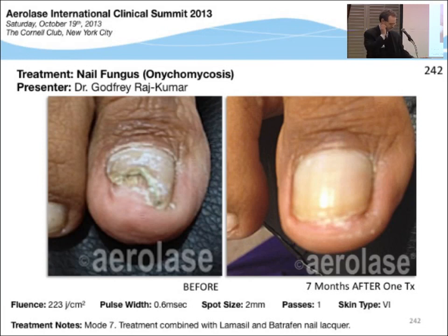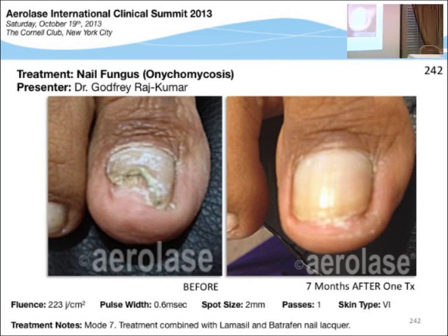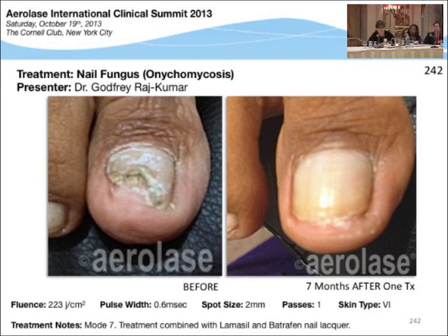Thank you. I use a Zimmer to cool, and I don't have an issue. A Zimmer is a cooling machine. I have it because of so many of my lasers, and I just blow really cold air through the Zimmer onto the patient's feet, and they tolerate it very well. Dr. Hepburn, what do you use?